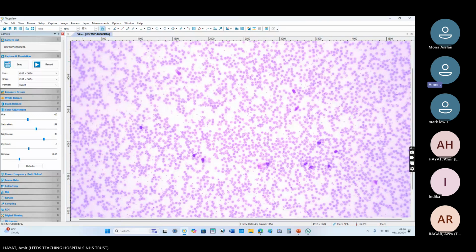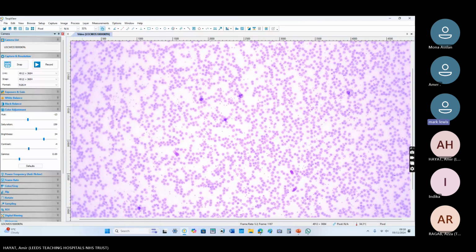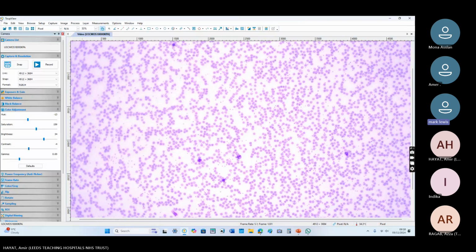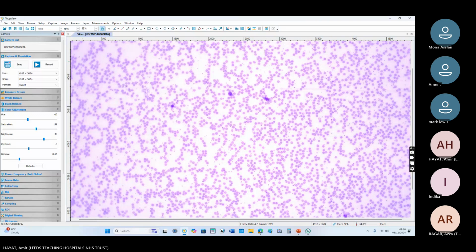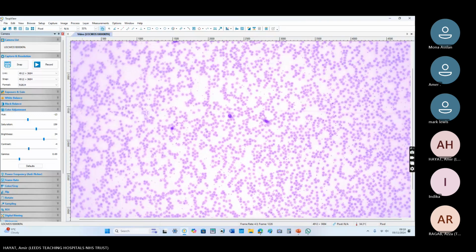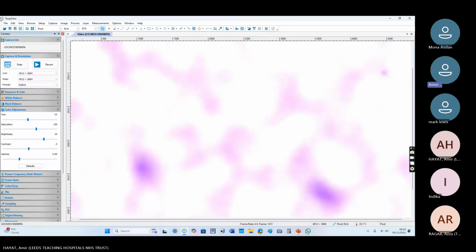Is there any volunteer who can start commenting on the blood film? The blood film will go to the lab first. It's definitely a thrombocytosis. Could be reactive. So we'll move to power 50, the oil side.